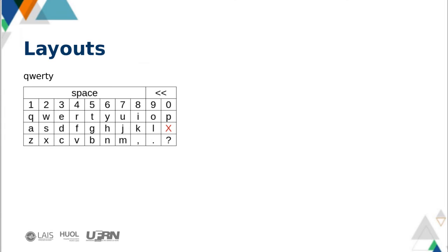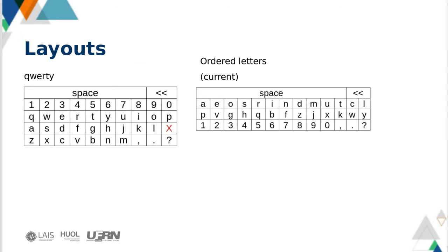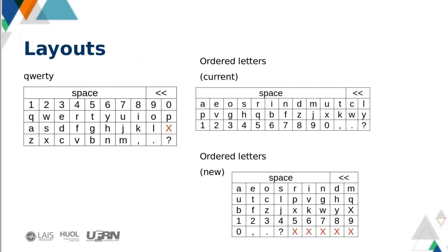We tested 3 different layouts. The normal QWERTY, the one explained before that we are using in our solution, and another form of the same keyboard, but this time with more rows. We are testing this new layout, the one with more rows, to show the power of the line column scanning method. By definition, this method of scanning works better in a more square shape.